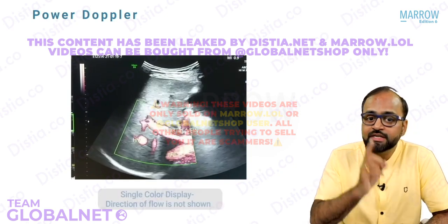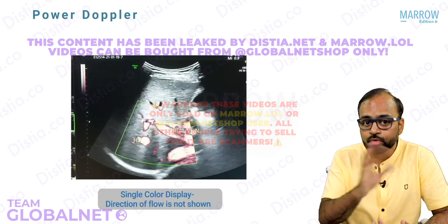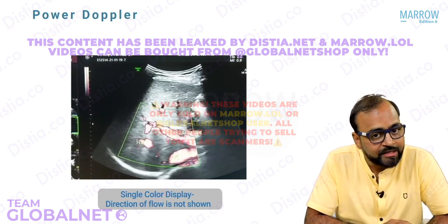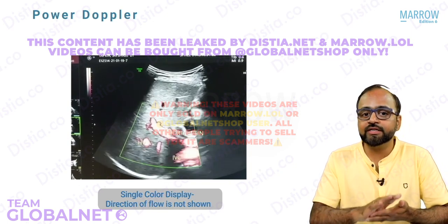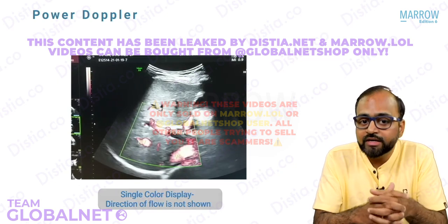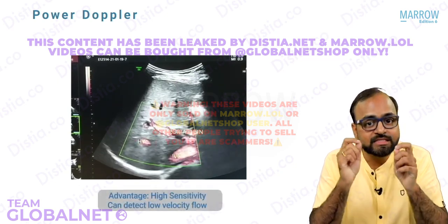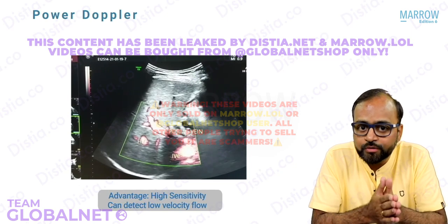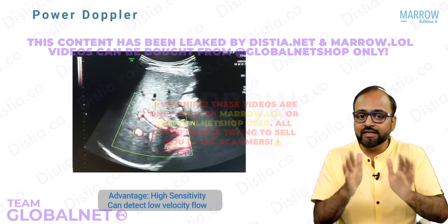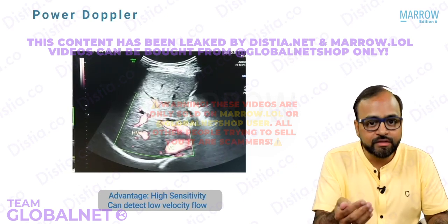Can you see? It is a single color scale. There are no two colors, red or blue, right? So it is a single color scale, meaning that it does not give us the direction of blood flow. Towards or away, it cannot tell us. But its advantage is that it has very high sensitivity for detection of color flow. That is the advantage of power Doppler, but still it is subjective. I cannot measure the flow, isn't it?